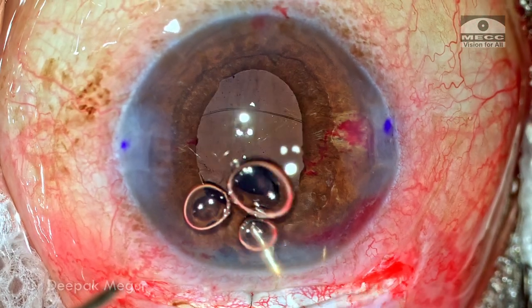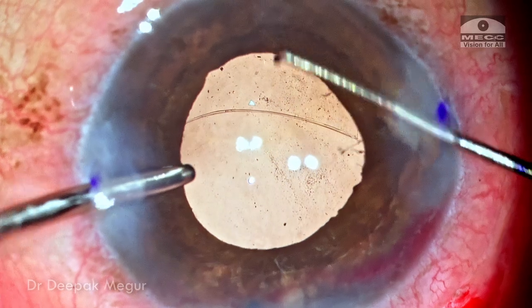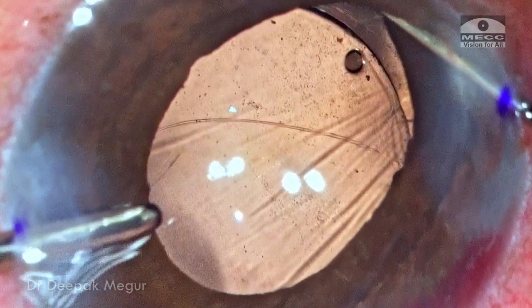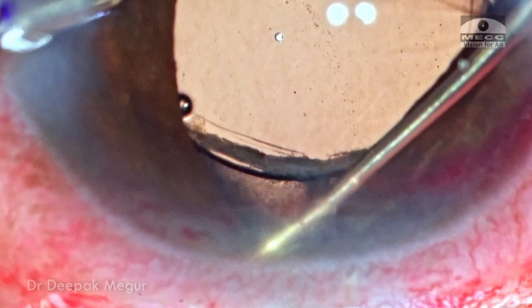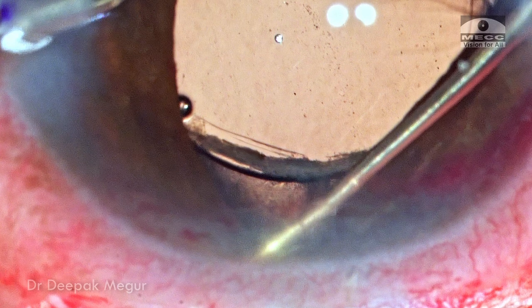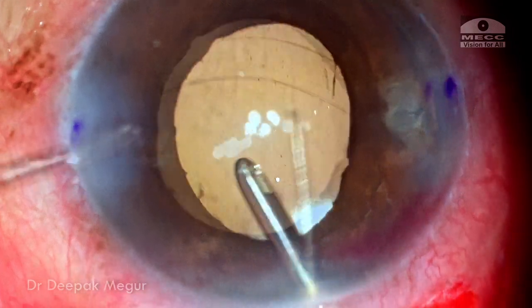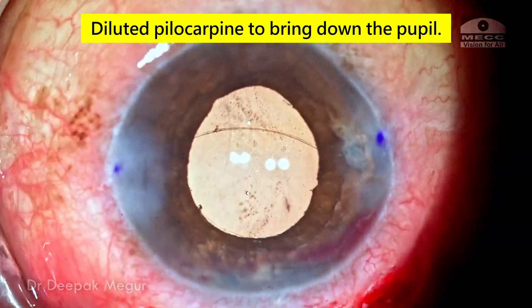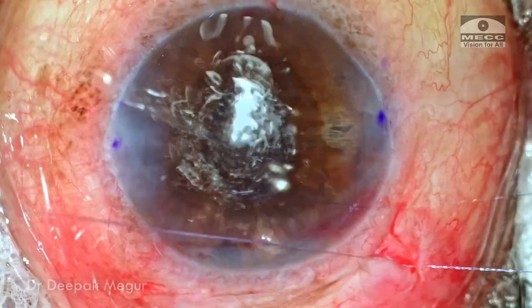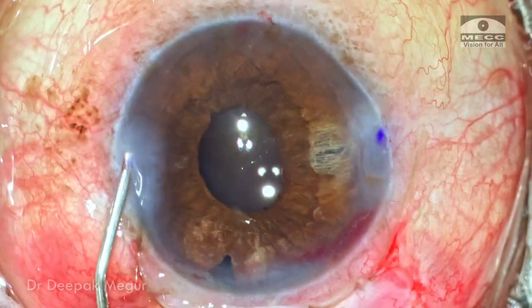The air bubble is removed and I check the centration and stability of the lens. Retracting the iris on the inferior side confirms the lens has adequate support over the capsule and is quite stable, as is the superior quadrant. I tap the lens to confirm it is stable and secure. Diluted pilocarpine is used to bring down the pupil. The conjunctiva is closed with two sutures on either end with knots buried inside. Intracameral antibiotic is placed inside the eye.